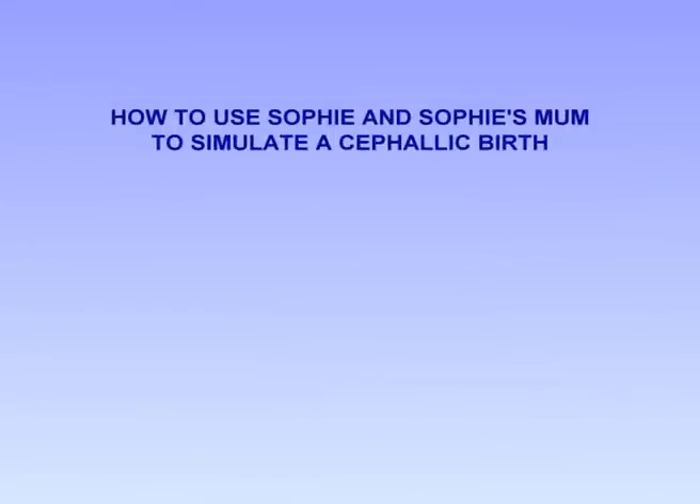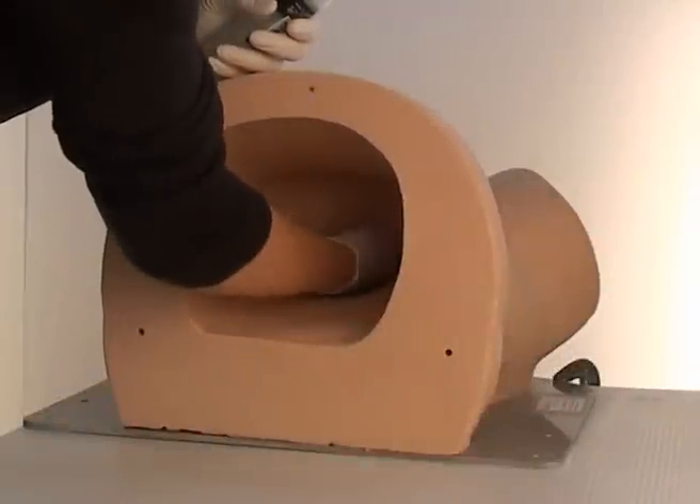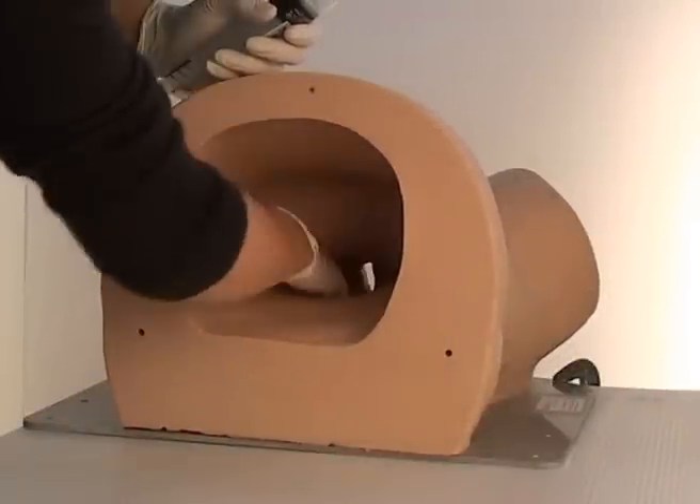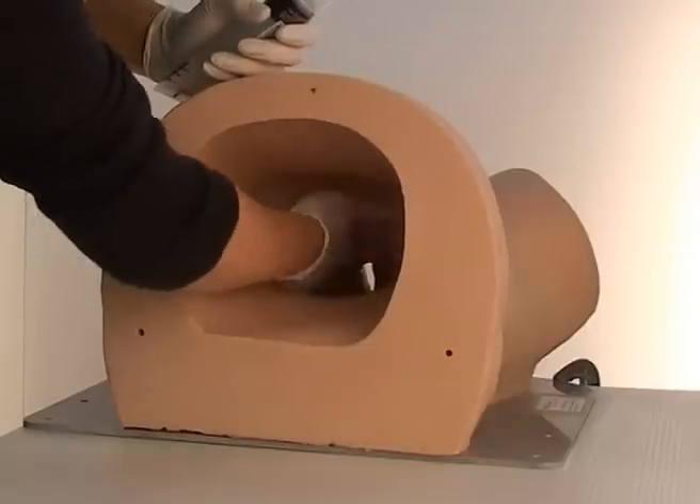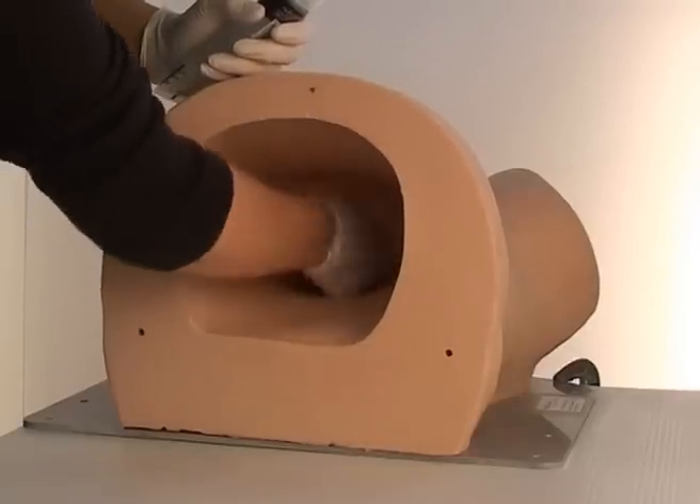How to use Sophie and Sophie's mum to simulate a cephalic birth. Before using Sophie's mum, make sure she is thoroughly lubricated with a water-based surgical lubricant throughout the entire birth canal. KY Jelly works very well.